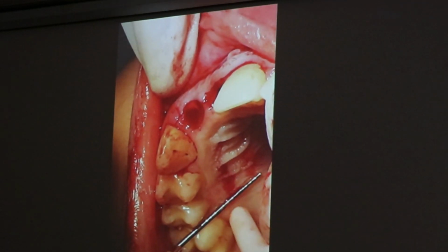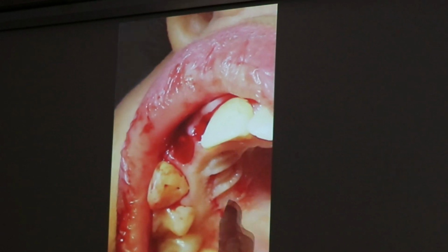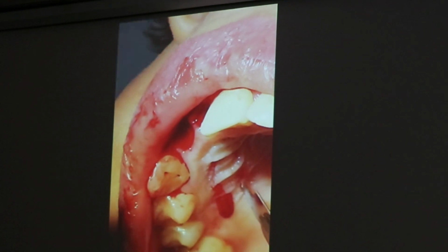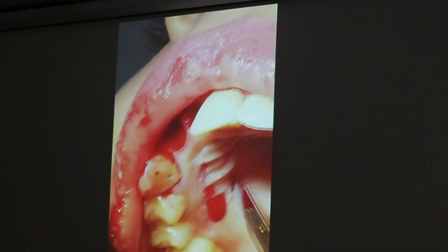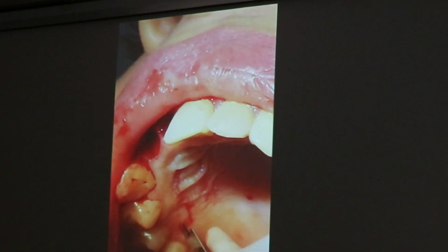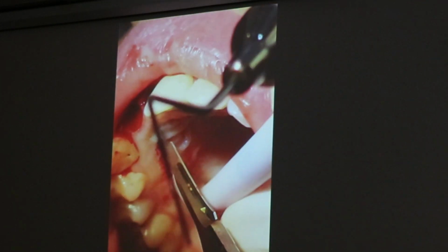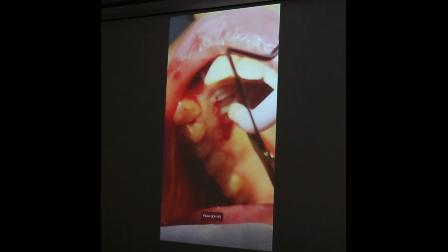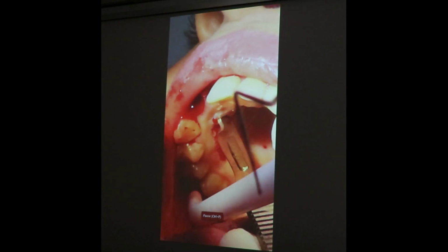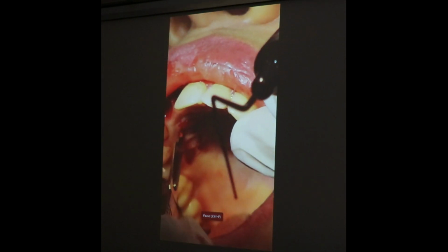Tunneling technique will not give us the papilla. I want to get back my papilla. See, let's go to this tunneling technique. What we did in the first phase was tunneling technique, and it did its job. What job did it do? While we were doing orthodontics, the thick gingiva did not make our existing thin gingiva become against us at the time of implant placement. As you saw, when I placed my implant, I did find sufficient soft tissue. But that was tunneling. To do tunneling at this point in time, I don't think it would have given me the papilla.